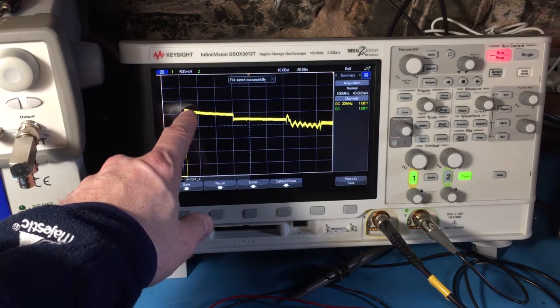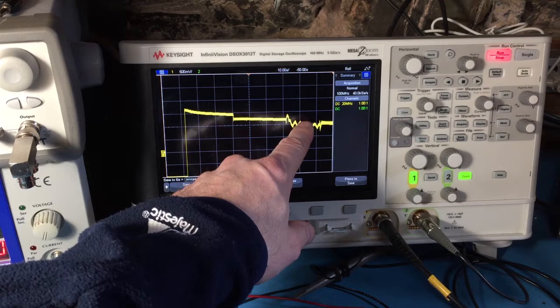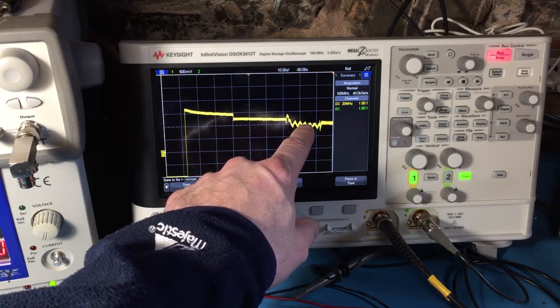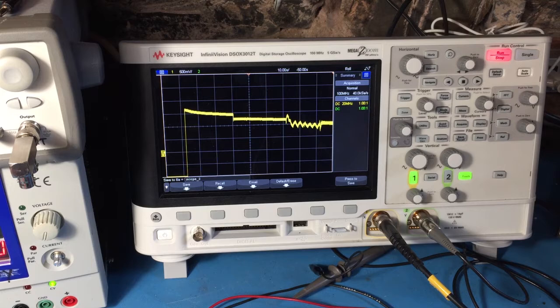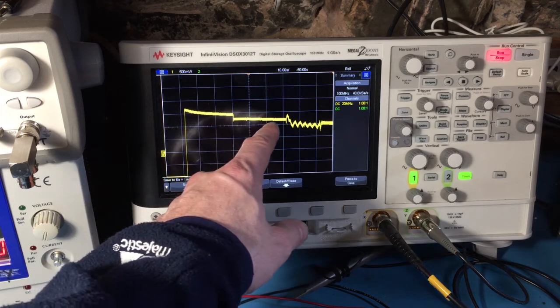And notice the drift is very slow. So you can see it's moving really slow. And the breath rate is at a much smaller time scale. We're on 10 seconds per division. So it looks like we're getting about 2 or 3 breaths per 10 seconds on there. And we want to build a modification to the circuit so that we could suppress the drift. And we'll talk about that in a little while.